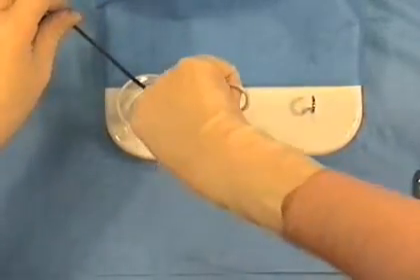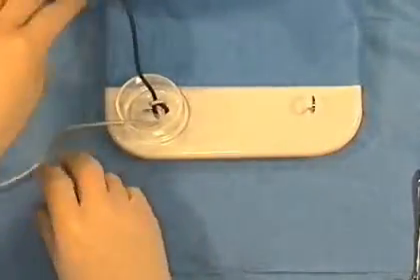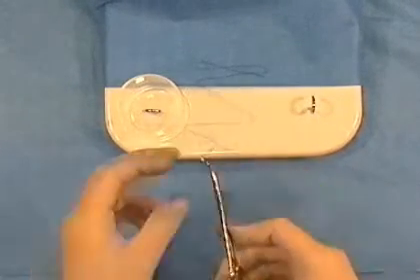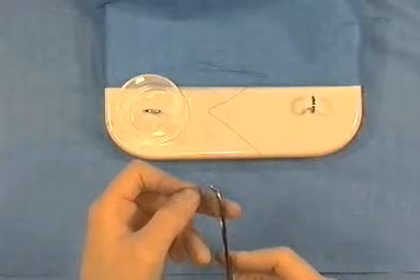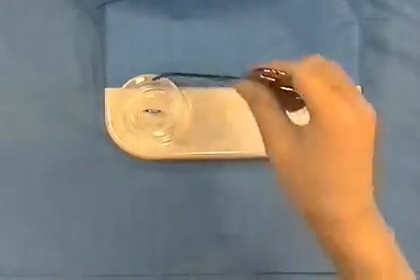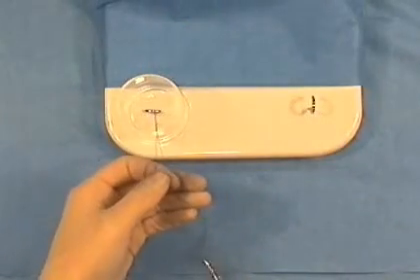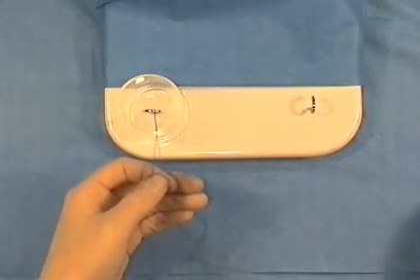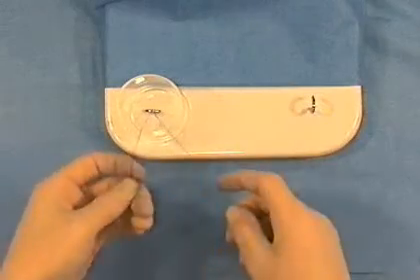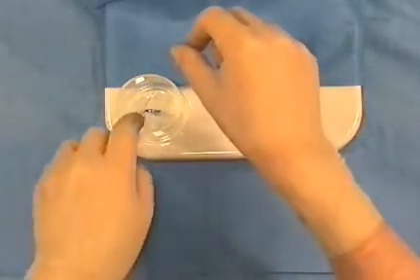On your jig is a model for tying a knot at depth. Practice this as shown in the video. Sometimes, it is necessary to tie a knot at depth. To do this, the surgeon should bow the knot around an instrument as shown. The suture should be placed around the vessel using the instrument so that the surgeon's hands do not obscure the field of view while placing the knot.